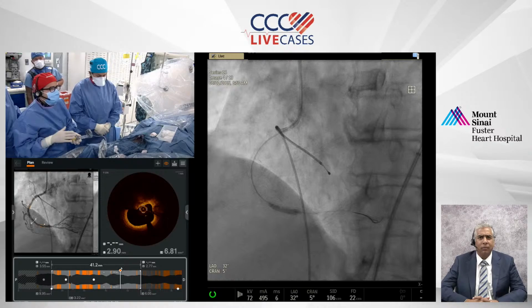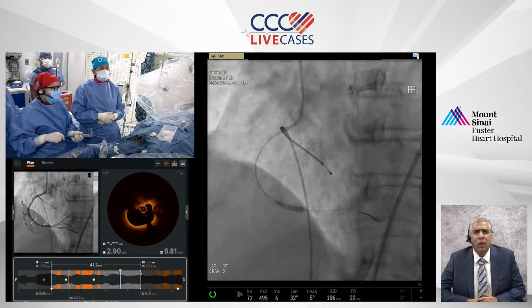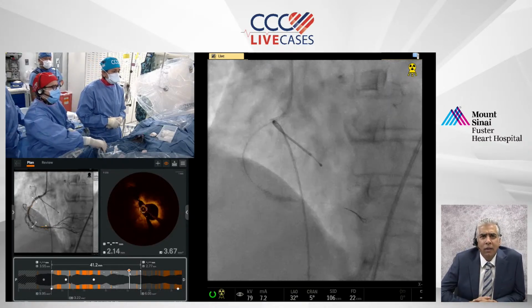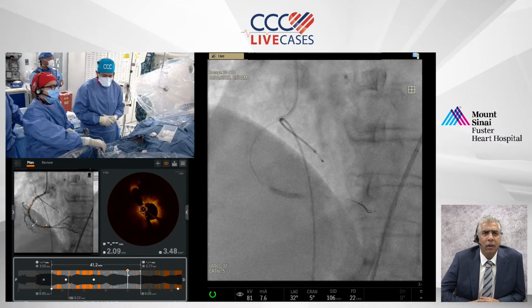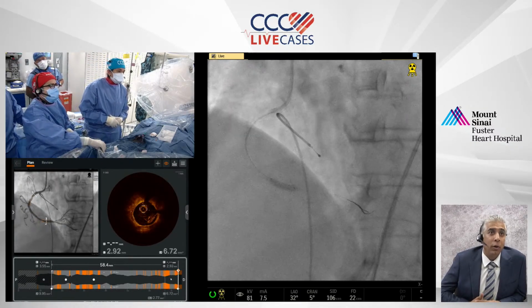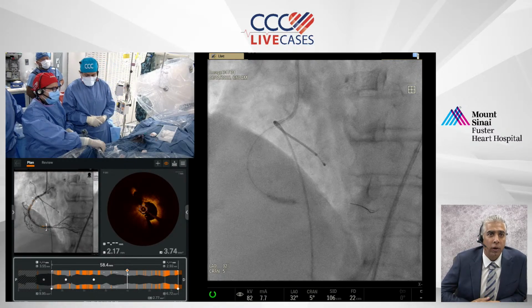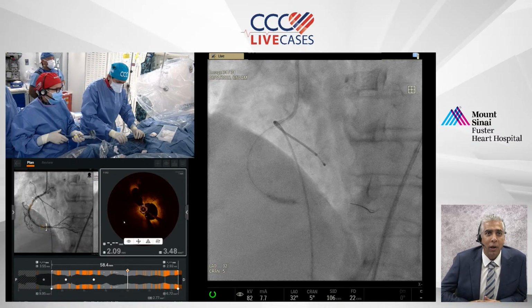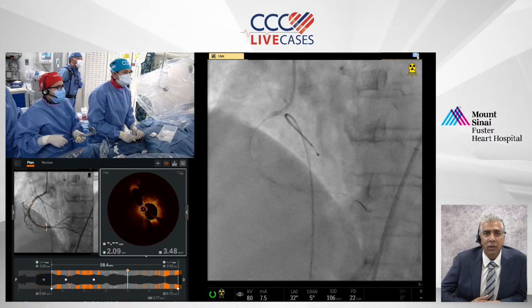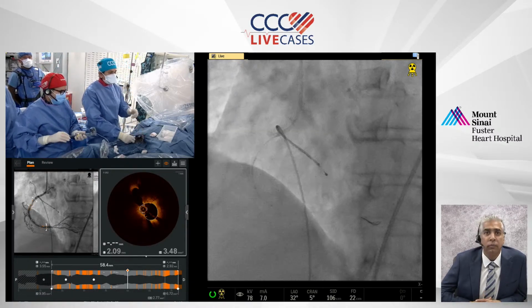We'll do one more. Give a little breather. Only thing, Nitin, we predict there will be ST elevations if we are not fast in this vessel. So we are going to do 2-2 at a place. You would probably agree that it wouldn't have been unreasonable to empirically use a 4.0 NC, but I think saving steps is important in these elderly patients. She's had heart block, she's had ST elevation, I think the planning has a value in terms of the efficiency as well. Let's do one here. Go up. Let us see.